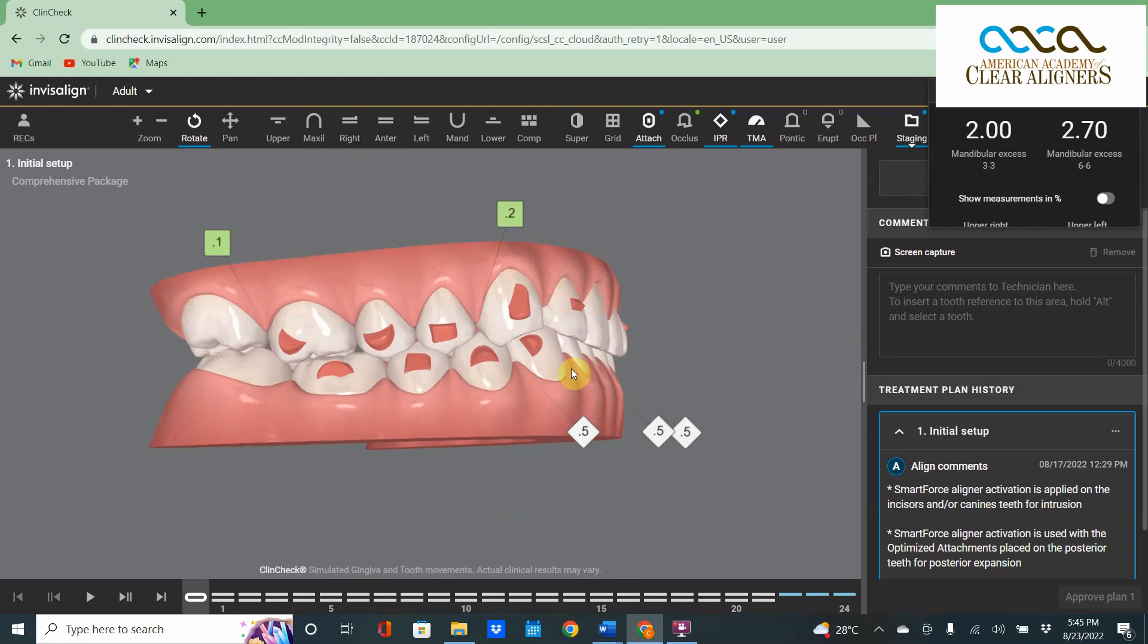This is actually a Class III person if the upper anterior teeth would not be closed in so tightly on those. If there wouldn't be upper anterior teeth, those lower teeth would express forward quite a bit and the condyle would come forward.